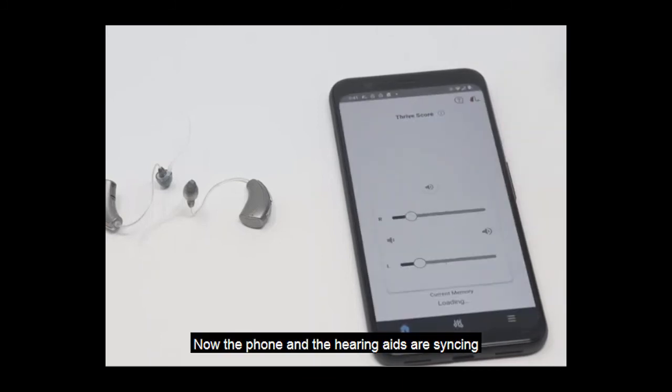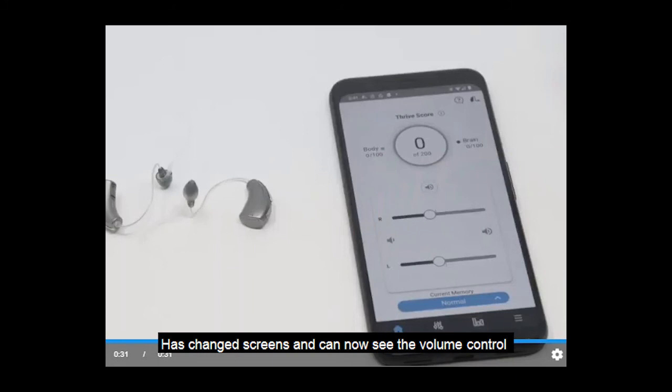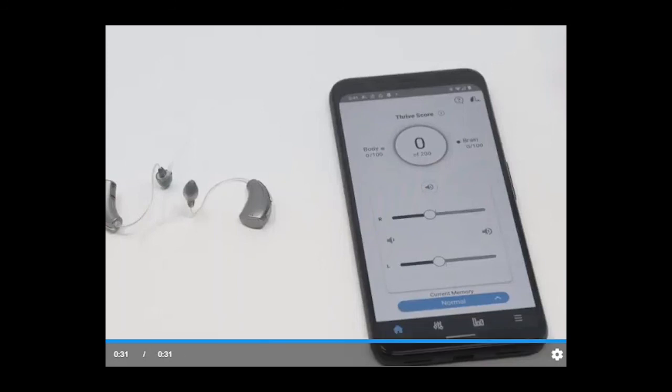Now the phone and the hearing aids are syncing and you can see that the Thrive app itself has changed screens and we can now see the volume control. This means you have been successful with pairing your battery-operated hearing aids to the Thrive app and Android phone.